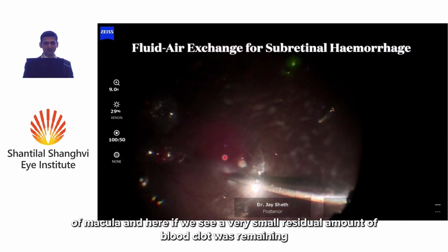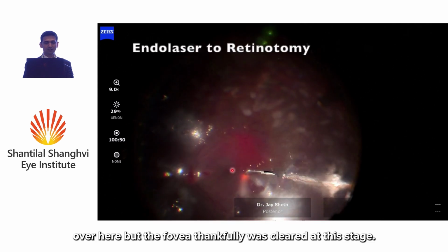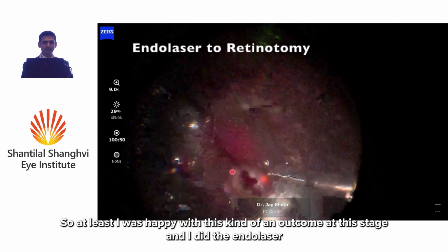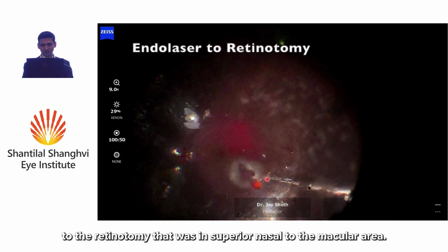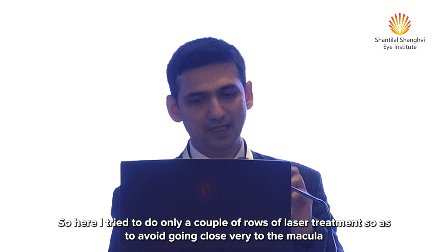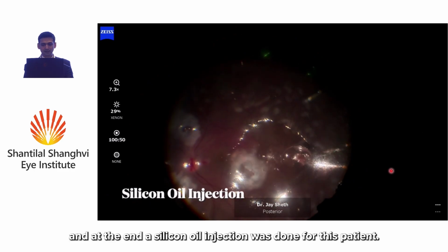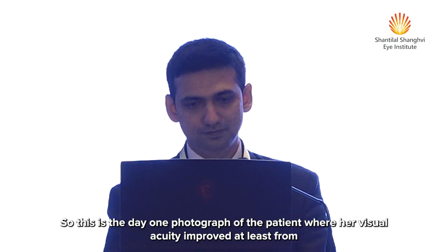And here we see a very small residual amount of blood clot remaining, but the fovea thankfully was cleared at this stage. So at least I was happy with this kind of an outcome, and I did the endolaser to the retinotomy that was superior nasal to the macular area. Here I tried to do only a couple of rows of laser treatment so as to avoid going very close to the macula, and at the end a silicone oil injection was done for this patient.